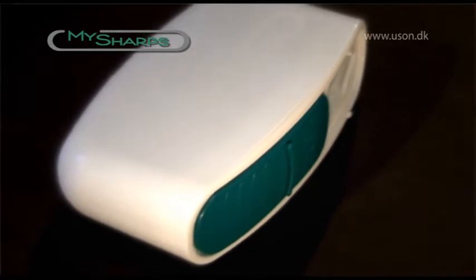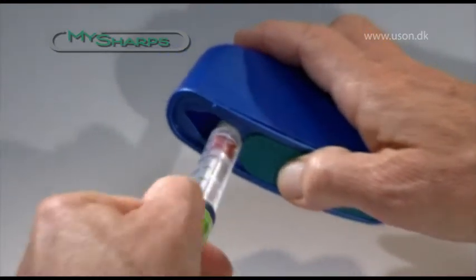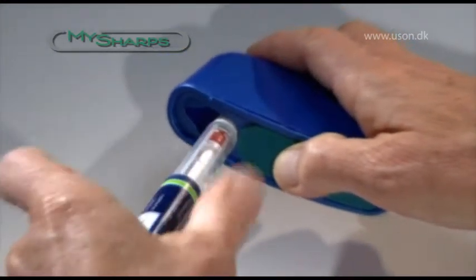The needles can easily be dismantled by inserting the insulin pen into the needle vent. You then twist the needle into the container.